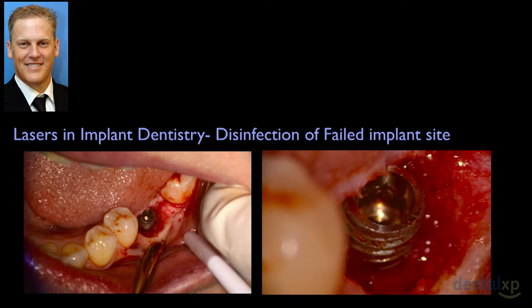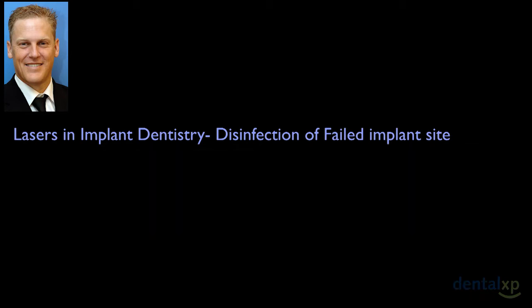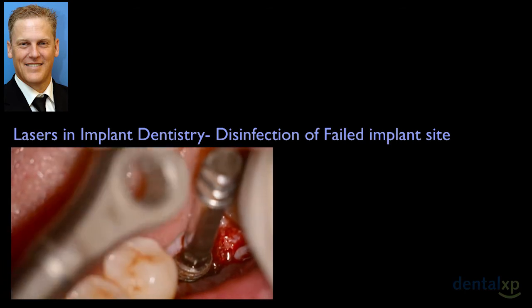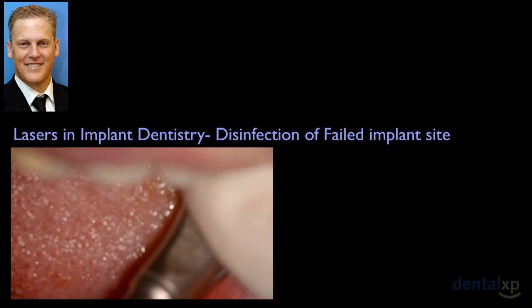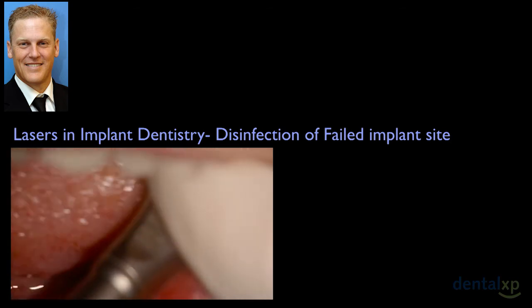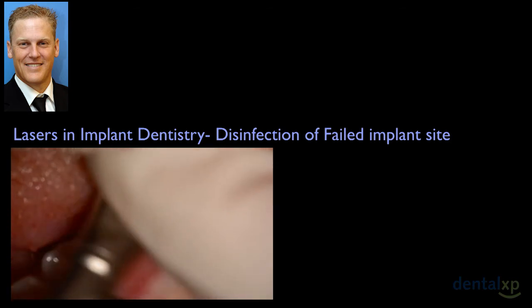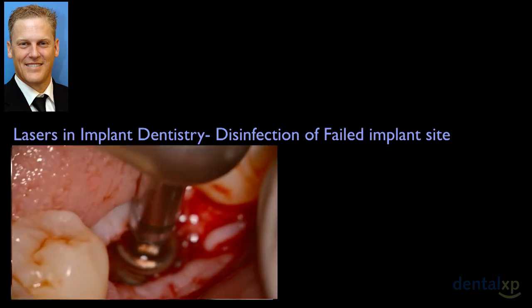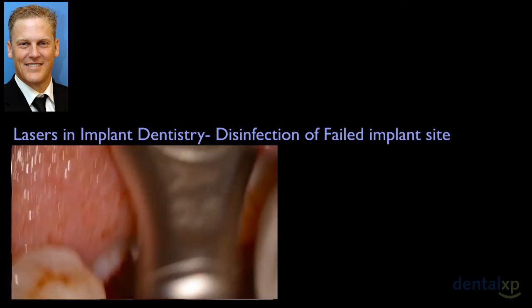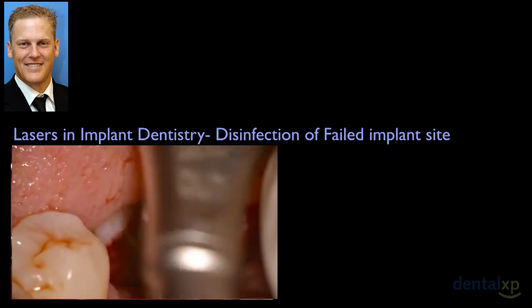Immediately afterwards, you had a circumferential defect, and I asked the patient at this point what she would like to do. And she was so tired of the implant, she said, "I just want it removed." So we then proceeded to take the torque wrench, go counterclockwise, and we were able to relatively easily remove the implant itself. You can see there the break of the bond, and here at higher magnification, a little blurry, you can see how we can remove the fixture.